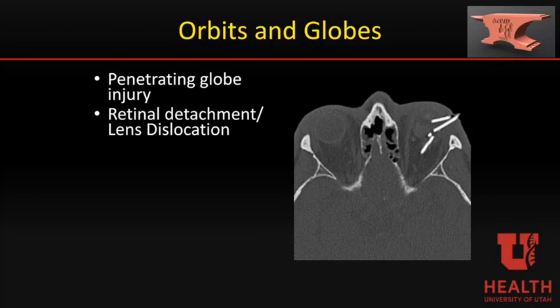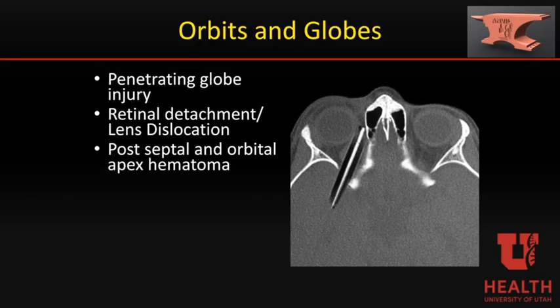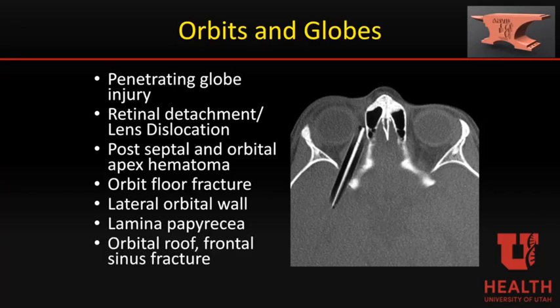In this patient with a graphite pencil injury, we have an open globe, vitreous hemorrhage, a lens dislocation, and a through-and-through injury to the globe. Here we have another patient with a pencil-related injury, and this narrowly missed the medial aspect of the sclera and then was funneled through the orbital apex through the optic nerve into the middle cranial fossa. And as previously considered, always look at the four walls of the orbit to look for additional extension.